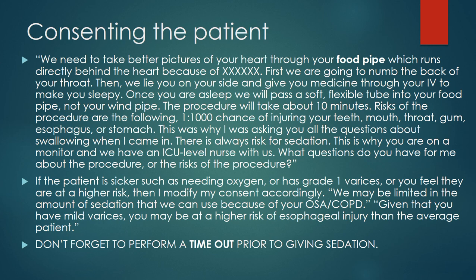A 1 in 1,000 chance of injuring the teeth, throat, gums, stomach, or esophagus. This was why I was asking all the questions when I came in regarding difficulty swallowing, problems with sedation. There's always a risk with sedation, and this is why you're on a monitor, and we have an ICU level nurse for this procedure.